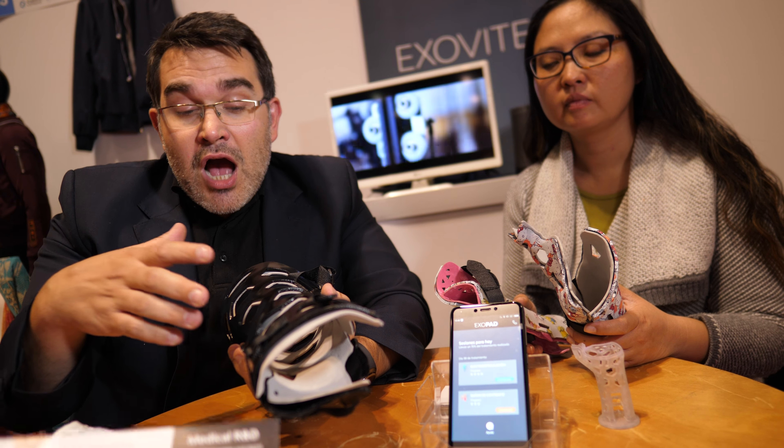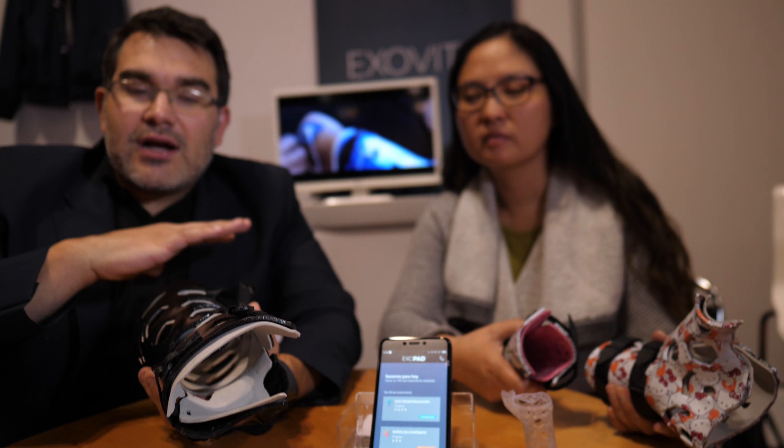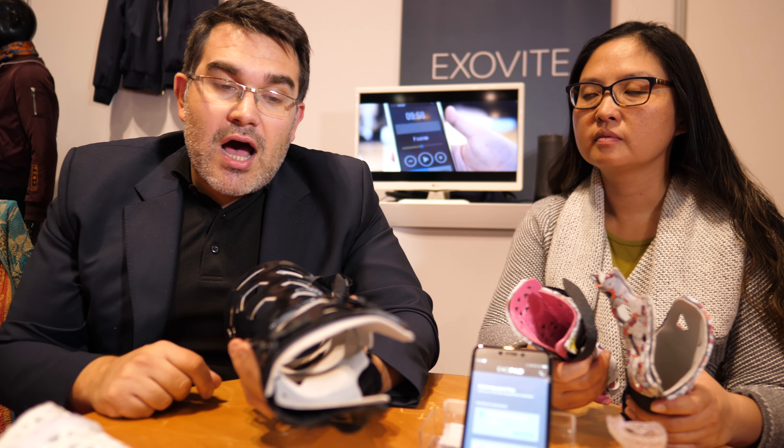If you need to scratch, you can scratch your skin because it's easy. It's not more flexible — it's still hard — but it's more usable because you can configure it. And it's better because the patient is not suffering on a plaster. Also, the doctor can check what's going on inside. And we can do this in five minutes.